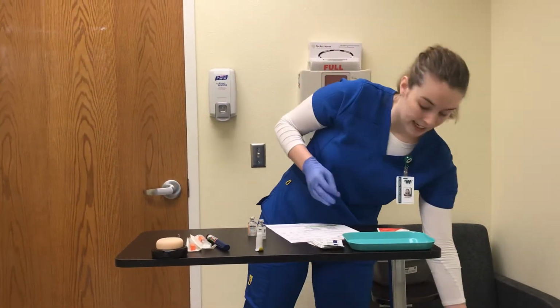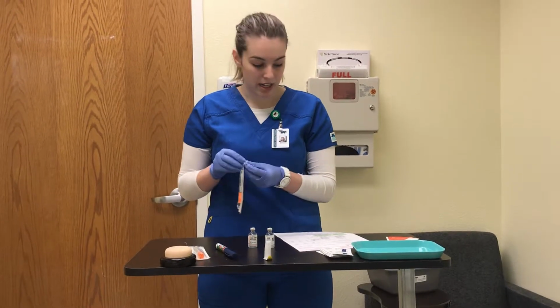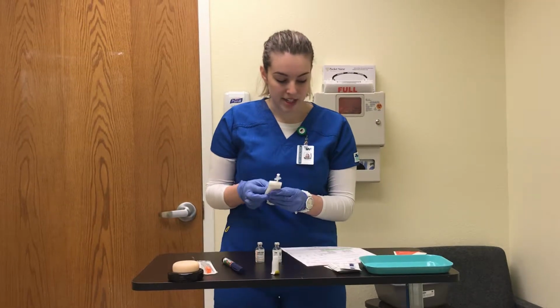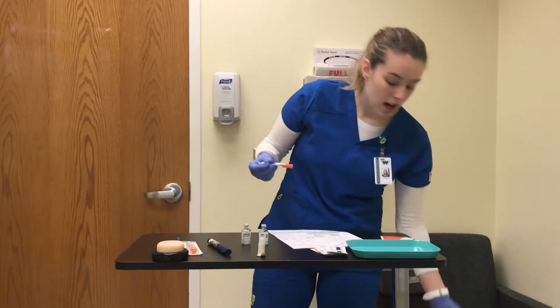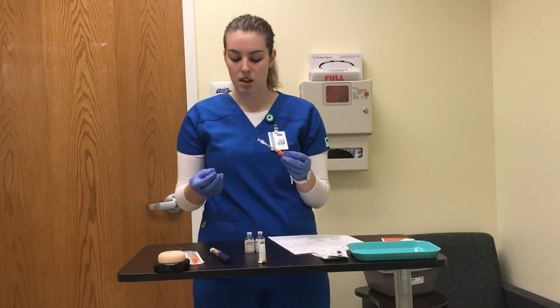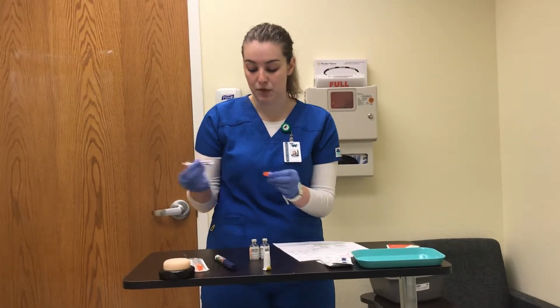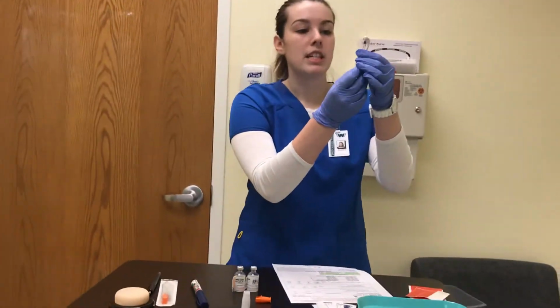So now that those are clean and my back has not been turned to the field, I know that I can go ahead and get my needle ready. So I need 15 units of the NPH and 10 units of this regular. Because we don't want to mix them once they're in each vial, I'm going to draw the air into the NPH first so it already has the air in it. So I'll need 15 units of air, as that is what I need for my NPH.